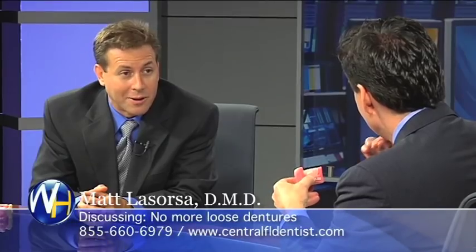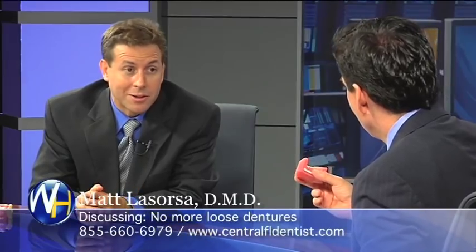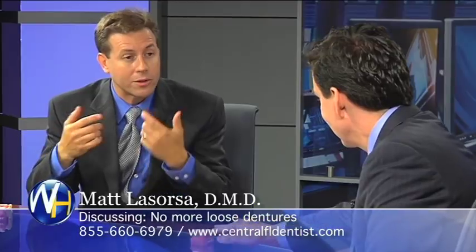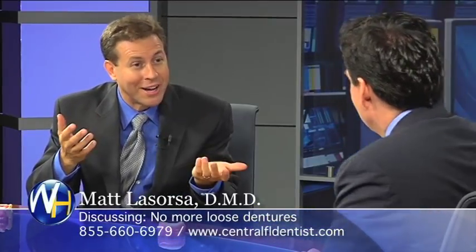So this right here snaps on a full arch of teeth. Full arch of teeth. Same day. Does it sound like that too? It sounds like that every time. This is accurate, and they could eat and chew whatever, as soon as the anesthetic wears off. I tell them I don't want them to go out and eat on them right away. They're still numb. They're going to chew on their lip. But after it wears off, you claim that a guy ate a steak that same night.